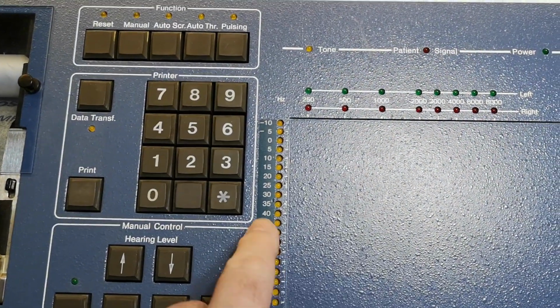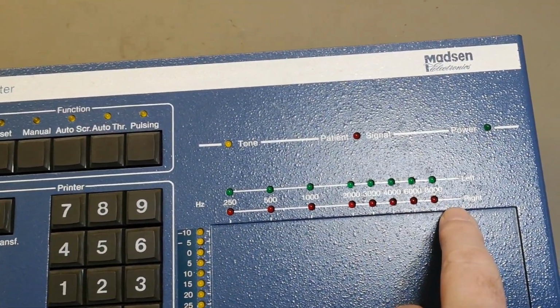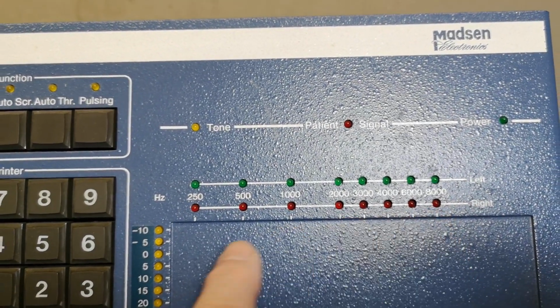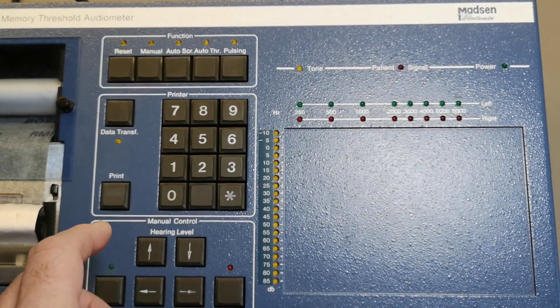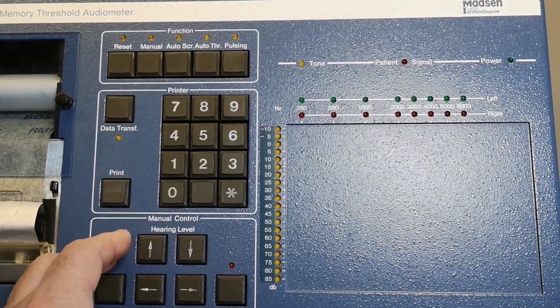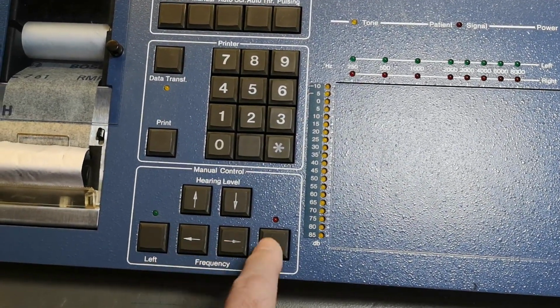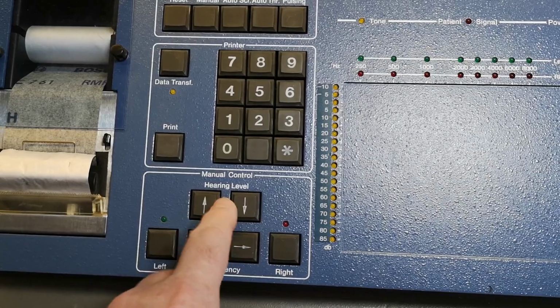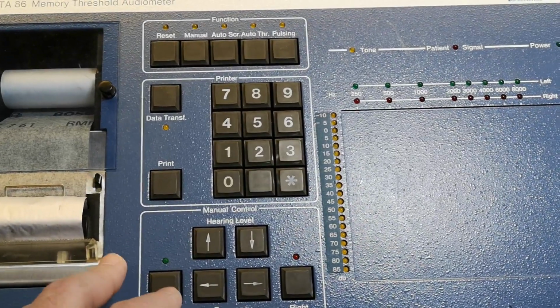So look, we got level and we got different frequencies. So the idea is that you use this to test people's hearing. The threshold for the lowest detectable sound. So you can change the level and the frequencies, and then you can say left and right. So this is the manual control, and then you can stimulate some hearing, some headphones, right?